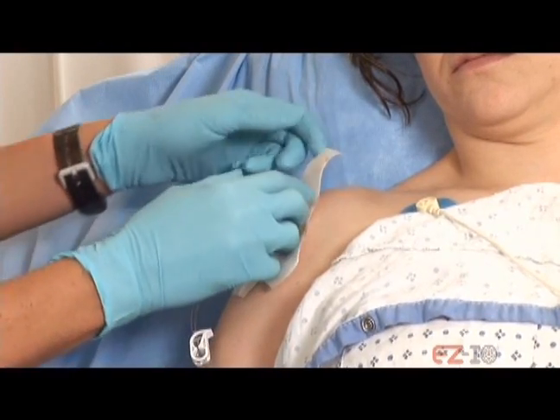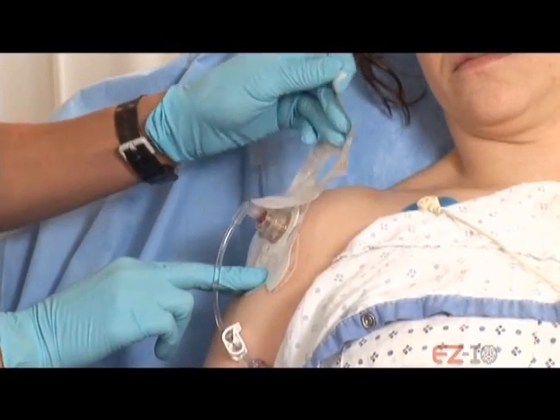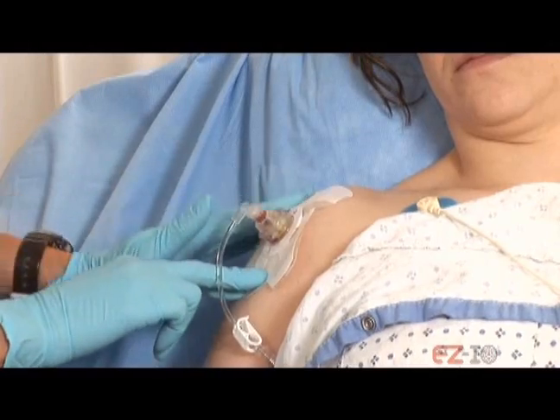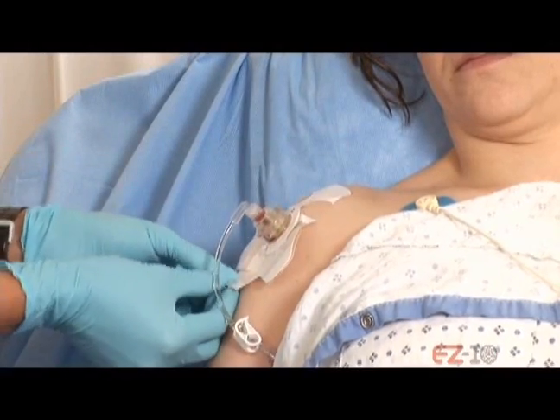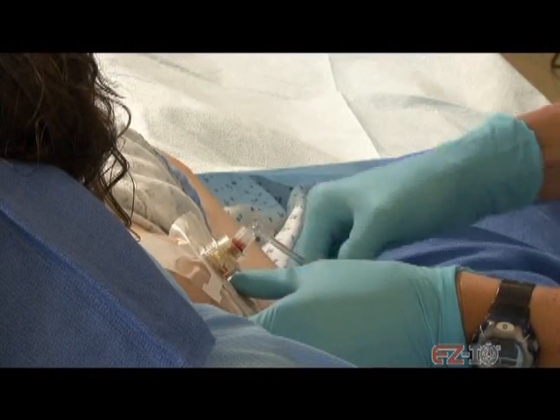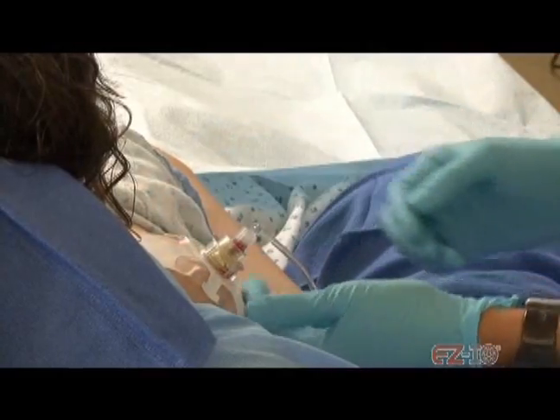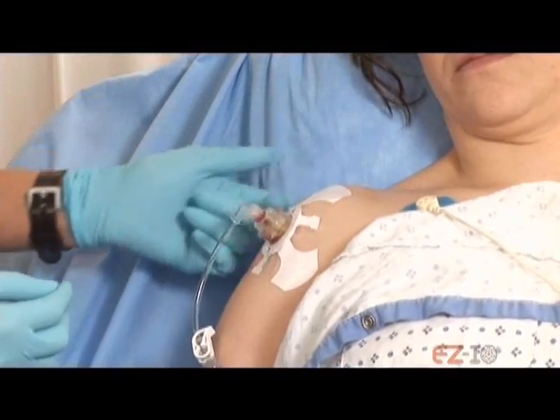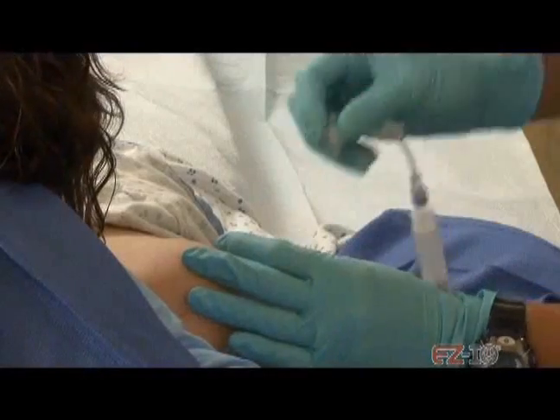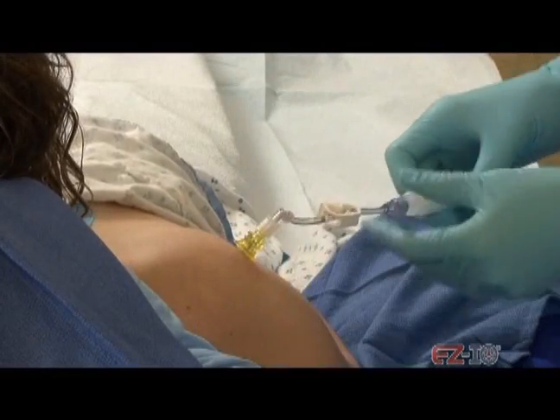Okay, now I'm just going to be securing these tapes down, okay? Remove tab 1 on the stabilizer to expose the adhesive. Then remove tab 2 on the stabilizer to expose the adhesive. Finally, ensure that the stabilizer securely adheres to the patient's skin. Prepare the site according to your protocol. Attach the Easy Connect to the catheter hub.